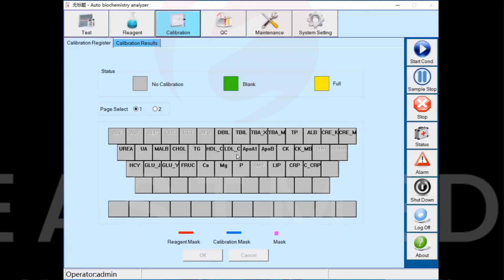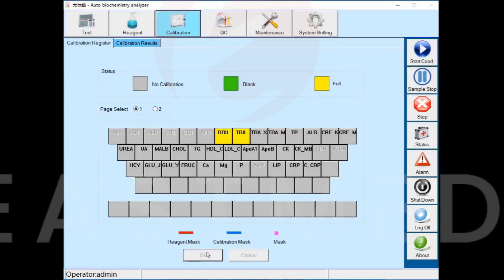The gray area shows items that do not need calibration, using the one-point linear method. Click on a black font item and the icon turns green — this performs only reagent blank calibration for that test. Click again and the icon changes to yellow, which performs a complete calibration. Change the color of items needing calibration to yellow, then click the OK button to complete the registration.